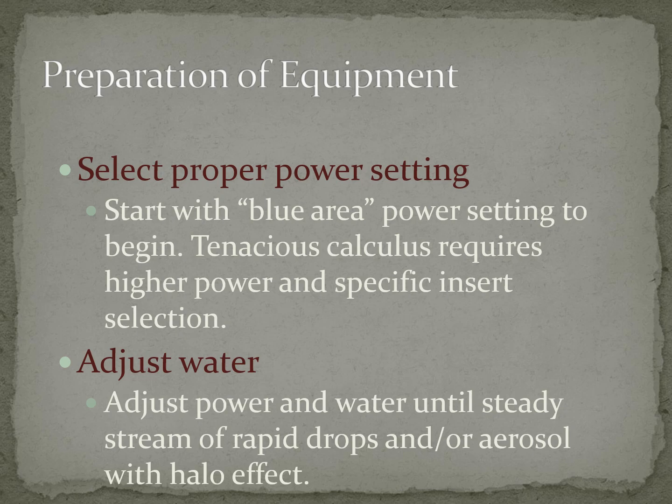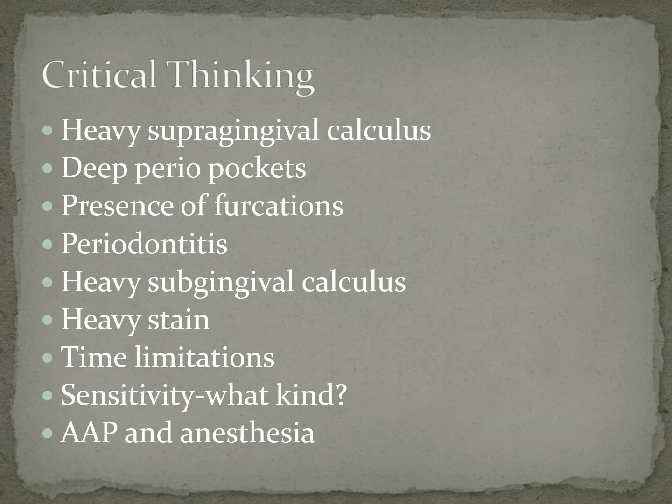You're going to adjust the power and the water until you see a steady stream of rapid drops and an aerosol with a halo effect. So again, I'm going to show you all of this, but you want to make sure that you have enough water, but not too much water. So we kind of have to find that happy medium.